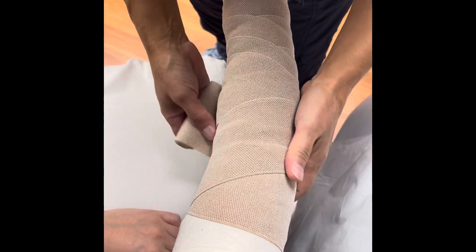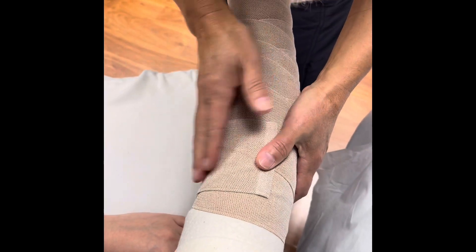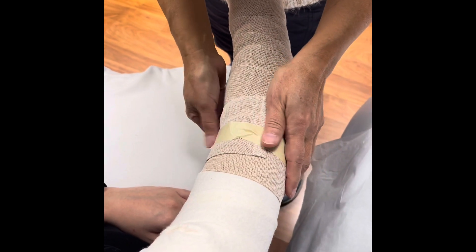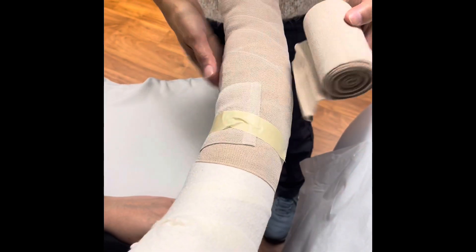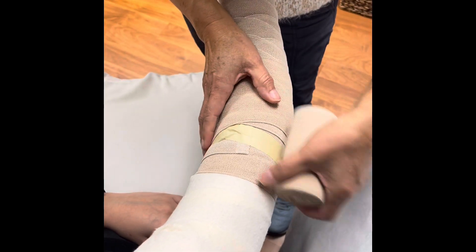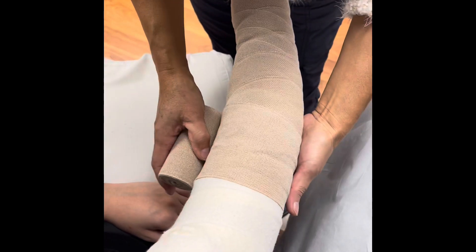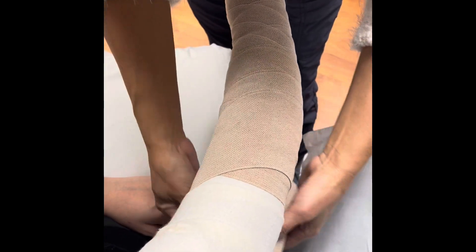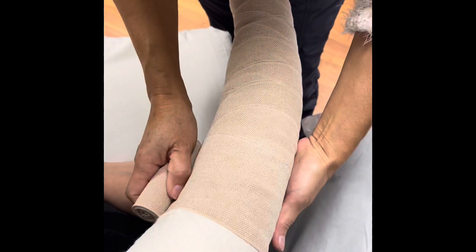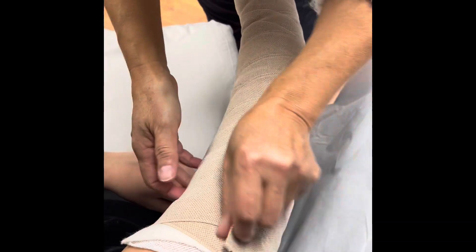This is an area where there's movement, so we want to maintain that mobility — we don't want to make it so tight that it's binding. We did extra padding on that elbow as well. We use another piece of tape to hold it in place, then do the last bandage. We start right below the elbow, anchor it, and go up. Not too much tension here because we already have the others. This is a wider band, and we're going to overlap half of its width.